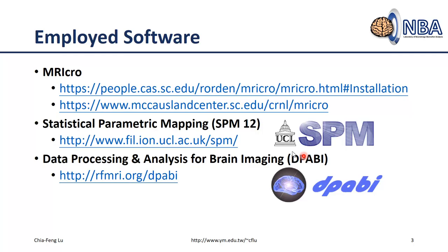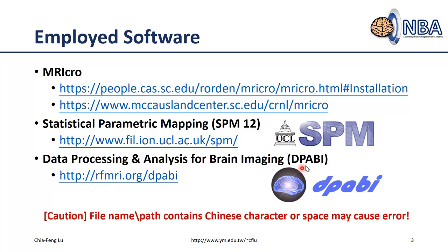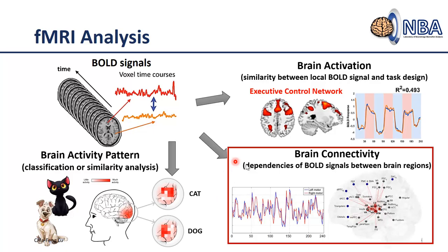If you attended class for the last two weeks, around week 9, you probably already have SPM12 and DPABI installed in your computer or included in the MATLAB environment. Just use DPABI and SPM12 today. Because DPABI includes SPM12, lots of functions come from SPM12. The requirement for file names and file paths is that no Chinese characters or spaces should appear in the file path or file name, or you may see errors when importing or loading files.